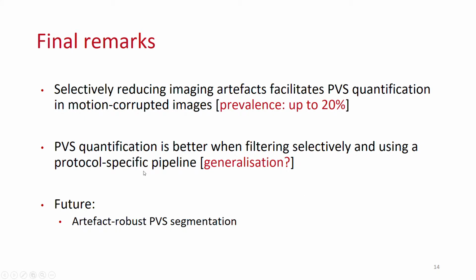However, coming up with multiple protocol-specific pipelines is not feasible, and so in the future, it might be better to look at some artifact-robust PVS segmentation strategies instead.